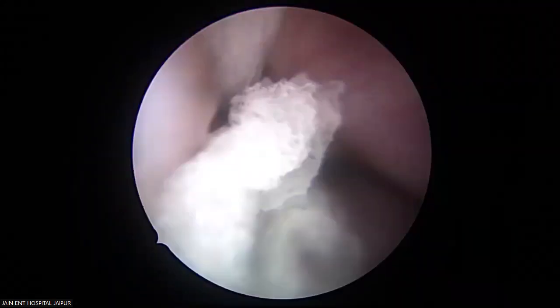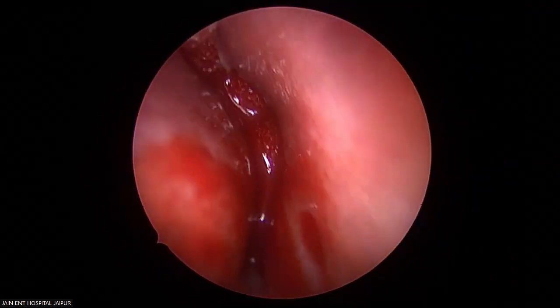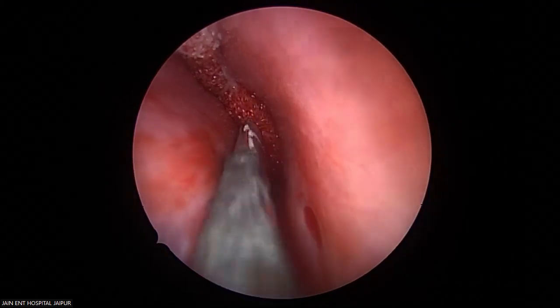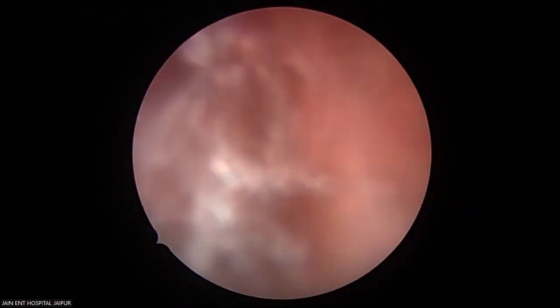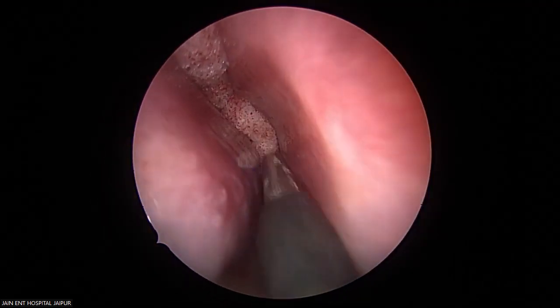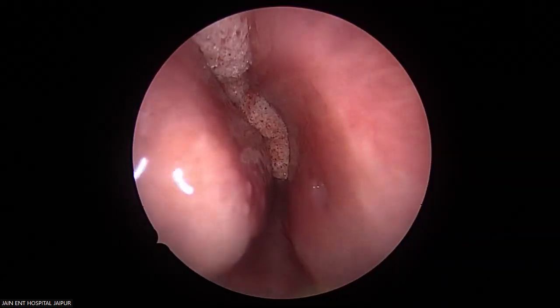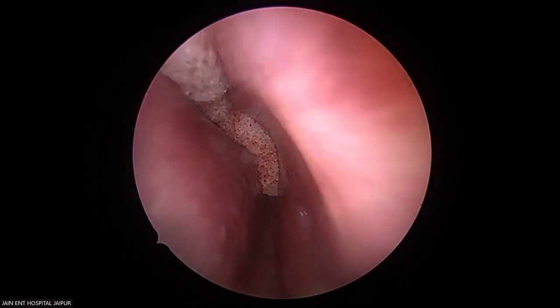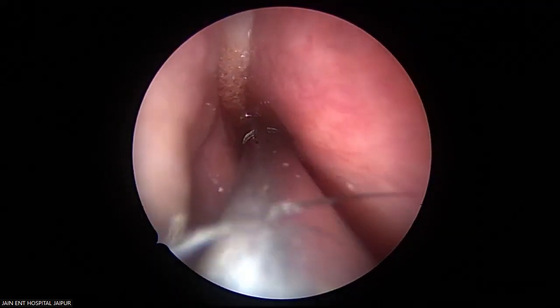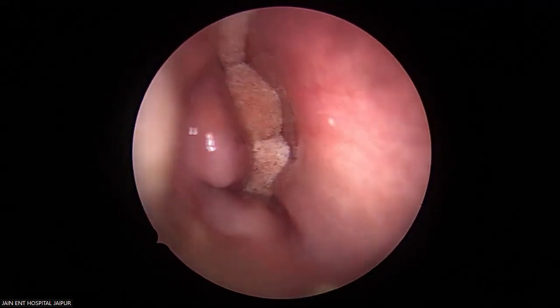See, the moment you touch it, it starts bleeding. Even the slightest contact on the surface gives bleeding. Can you see? But till now, the tumor does not know who is going to operate on it. After that, it will stop bleeding. You have to take the measures accordingly.